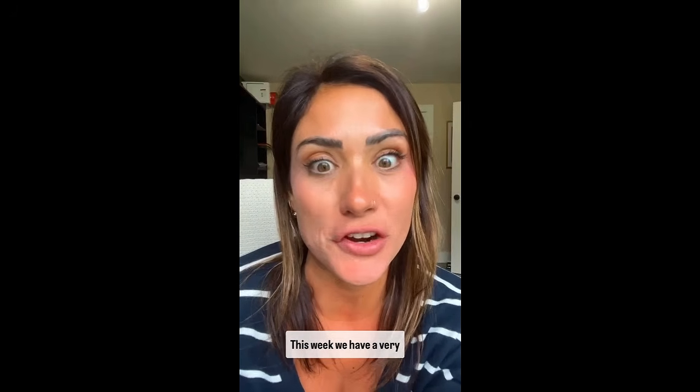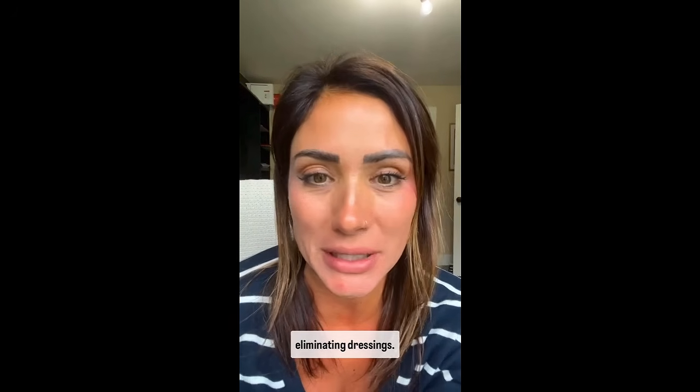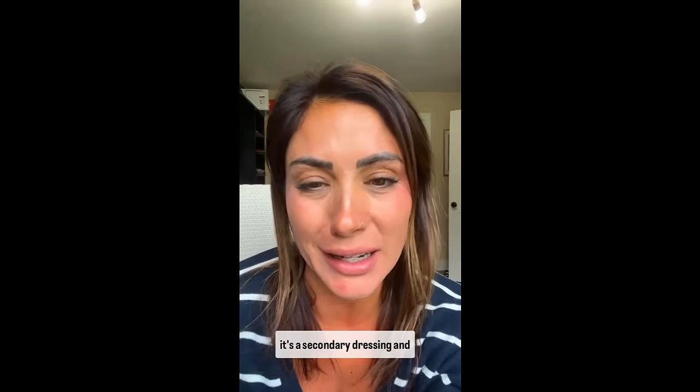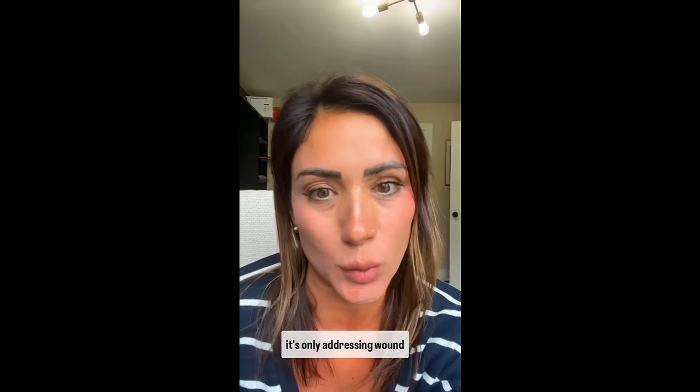This week we have a very unique category of odor eliminating dressings. This category is not really thought of that much because it's a secondary dressing and it's only addressing wound odor.